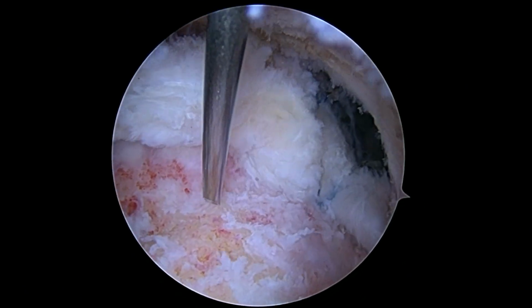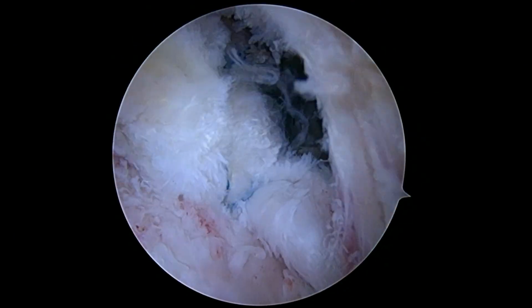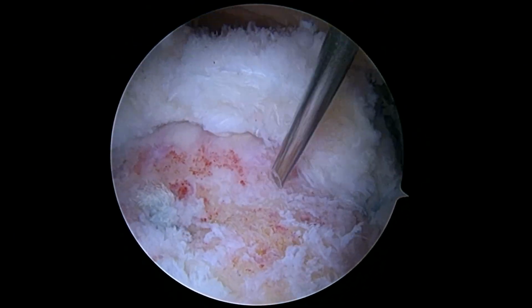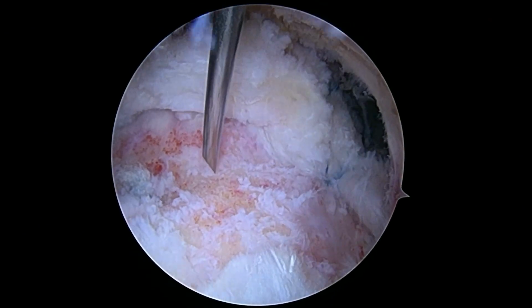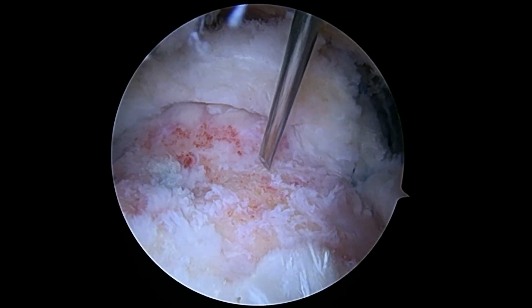Okay, so we've got the most posterior anchor placed and all 3 sutures tied. You can see it back here to the right. That's way in the back on the infraspinatus side of the rotator cuff. We're now going to place another suture anchor right here. And we'll go off on the video and show you when we're done with that.